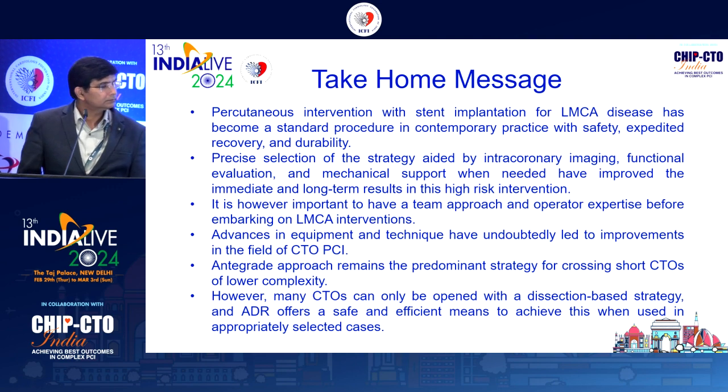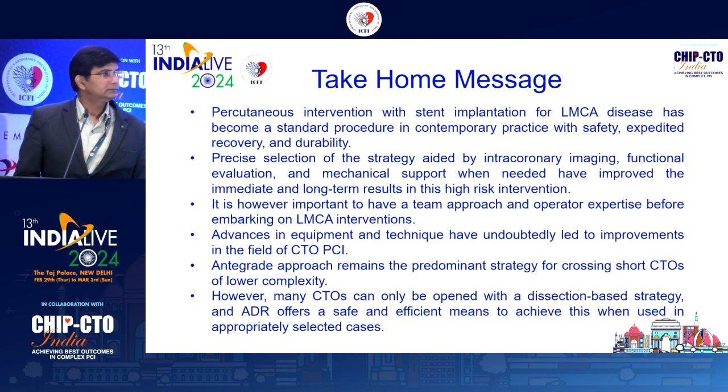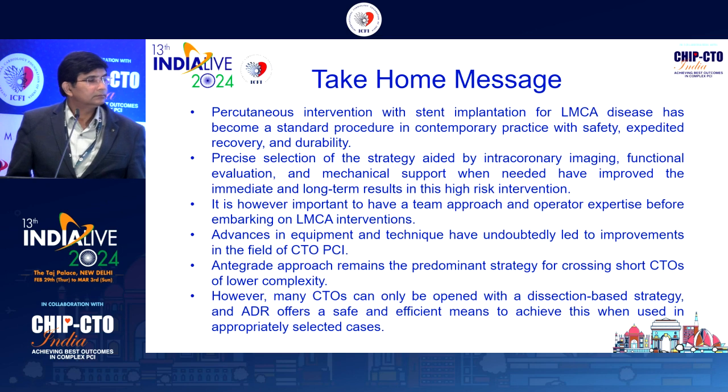I think the distal lesion in the LAD could have been treated earlier, prior to deploying the stent from left main to LAD. Distal to that portion of the stent is also LAD, diffusely diseased. So if we take a smaller balloon or larger stent from left main to LAD, it may be difficult to tackle the distal portion. So first mark the landing zone in the mid portion of the LAD, do left main to LAD, and after that the small balloon we can take distally like that.